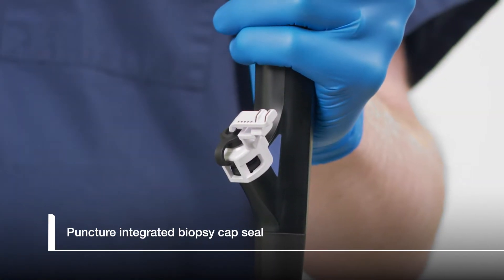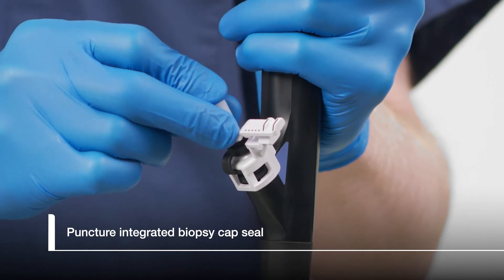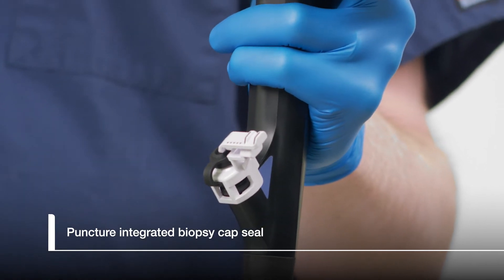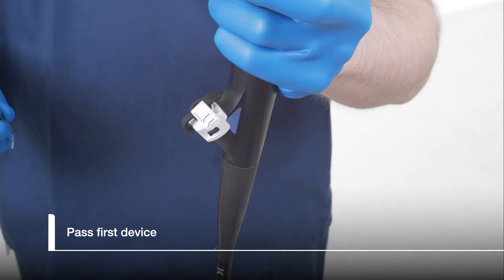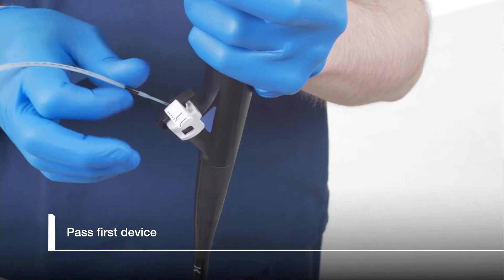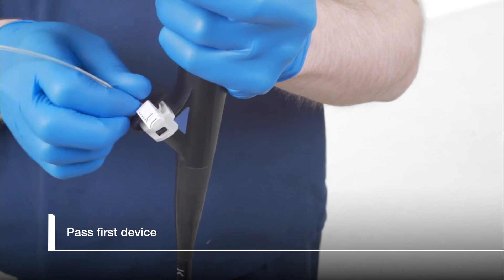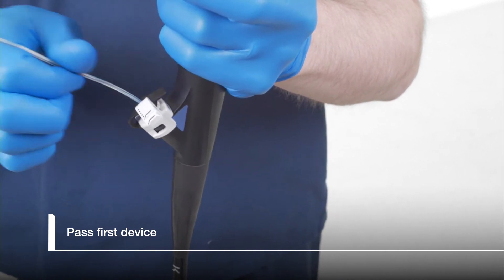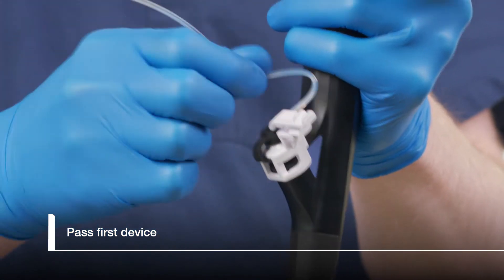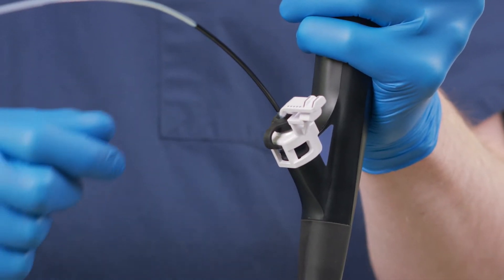Once CleverLock is secured to the biopsy port, puncture the seal on the biopsy cap by carefully inserting an endotherapy accessory, such as a guide wire introducer, through the slit on the biopsy cap. Gradually insert a device, such as a sphincteratome, into the center of the biopsy cap seal. Hold the device near its distal tip and use short throws to avoid kinking the catheter. Advance the sphincteratome down the endoscope working channel until the V marking reaches the biopsy cap seal. This indicates the tip of the sphincteratome is at the elevator.